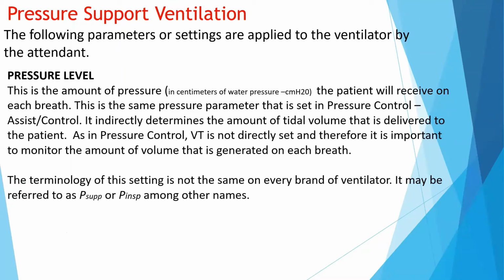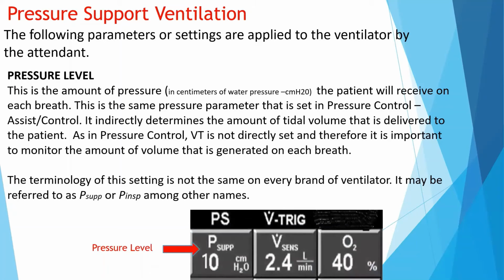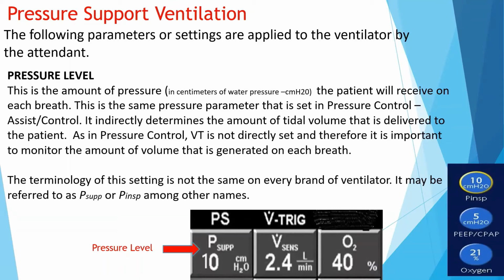The terminology for this setting is not the same on every brand of ventilator. It may be referred to as P support, P insp, among many other names. In this case, it's called P support, and in this case, it's called P insp.